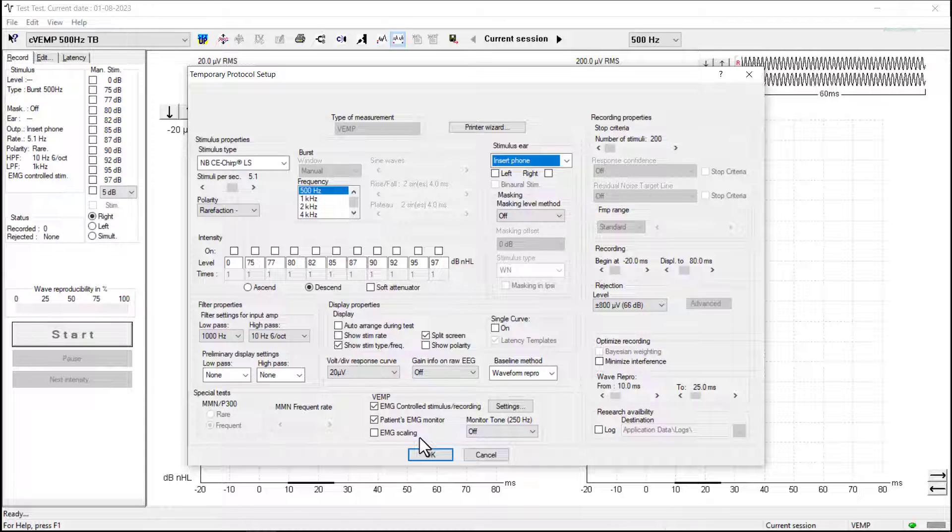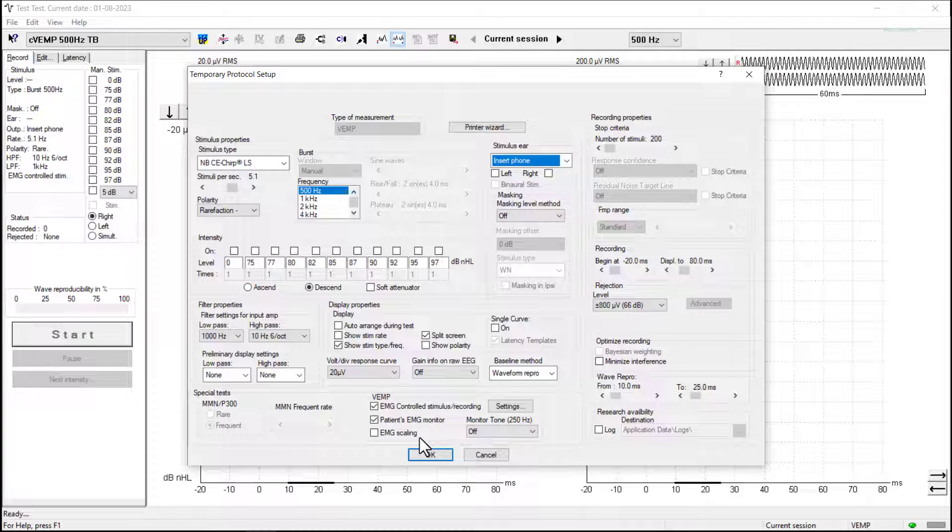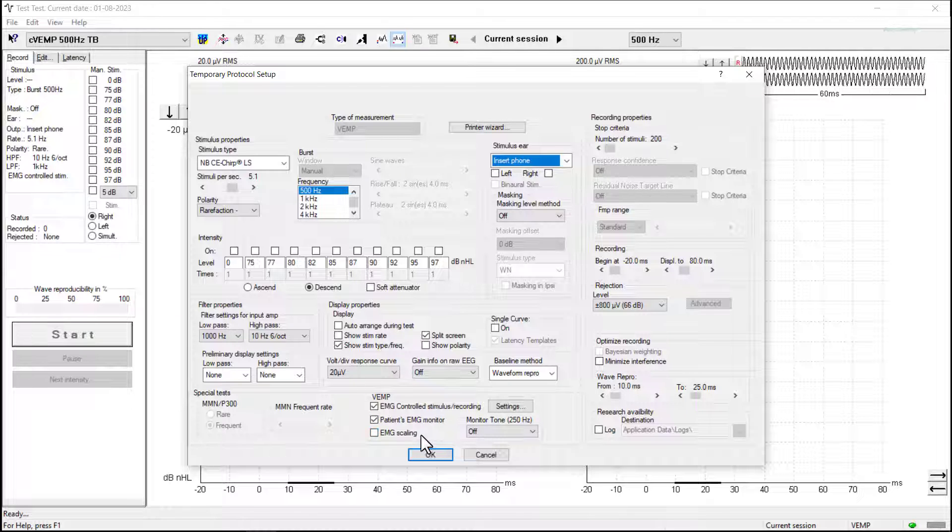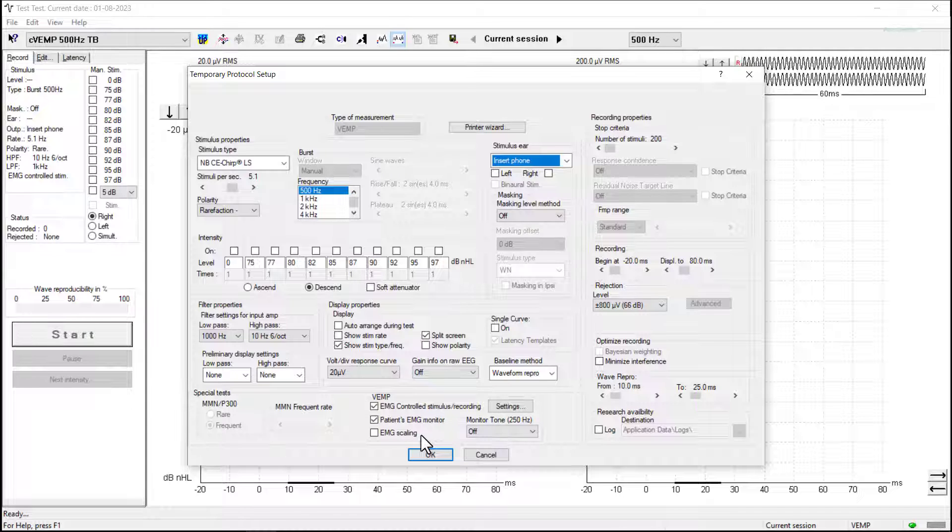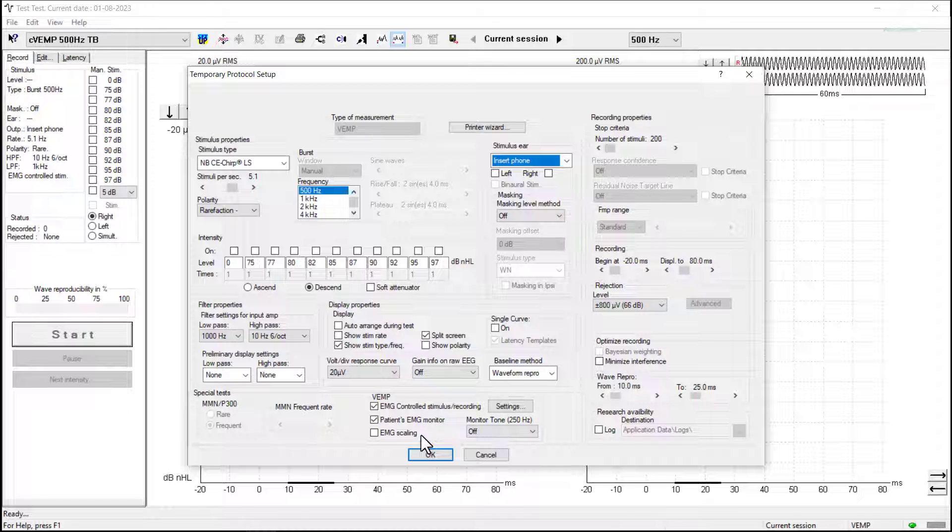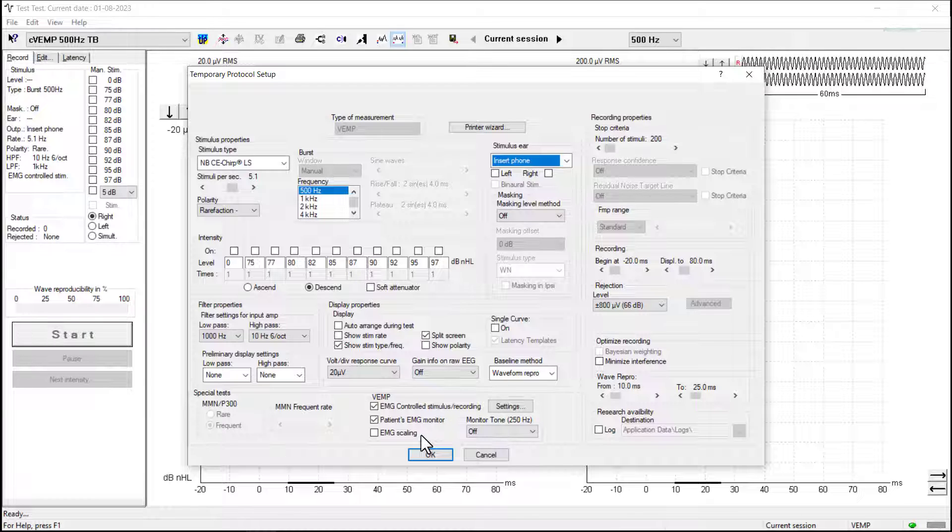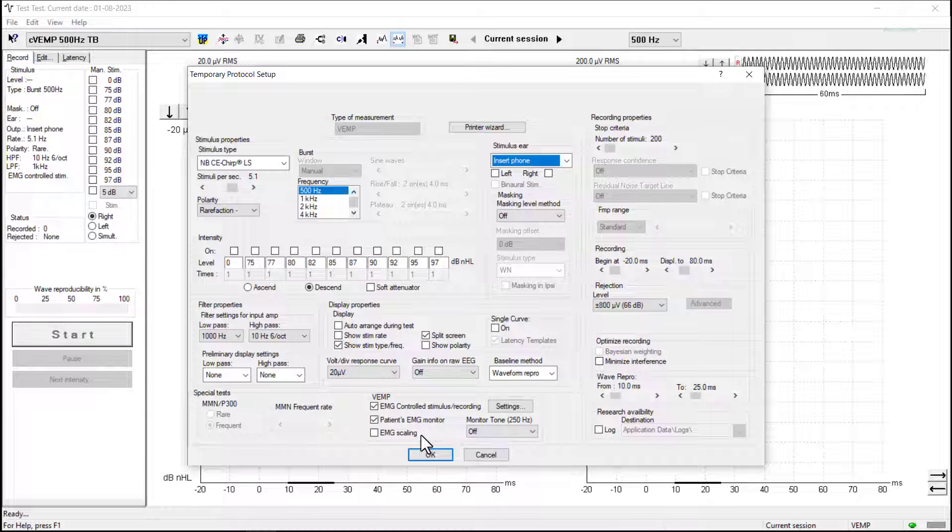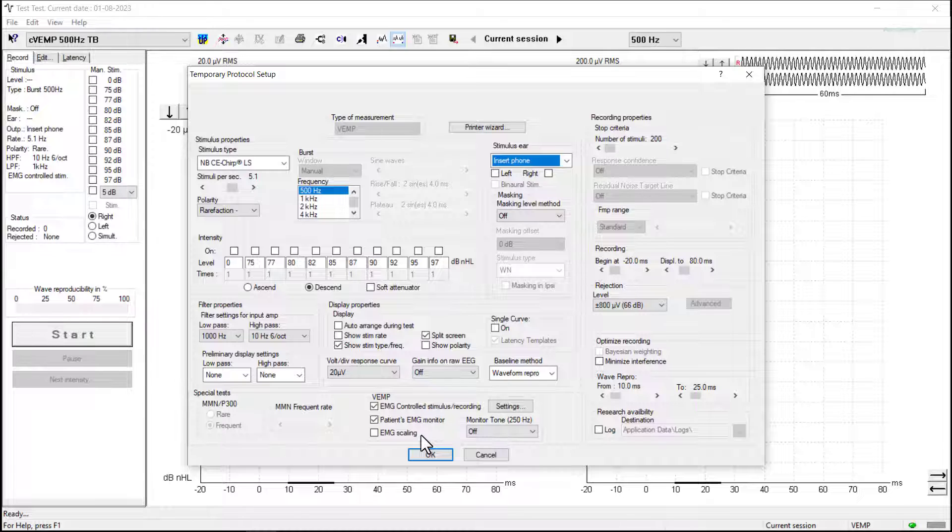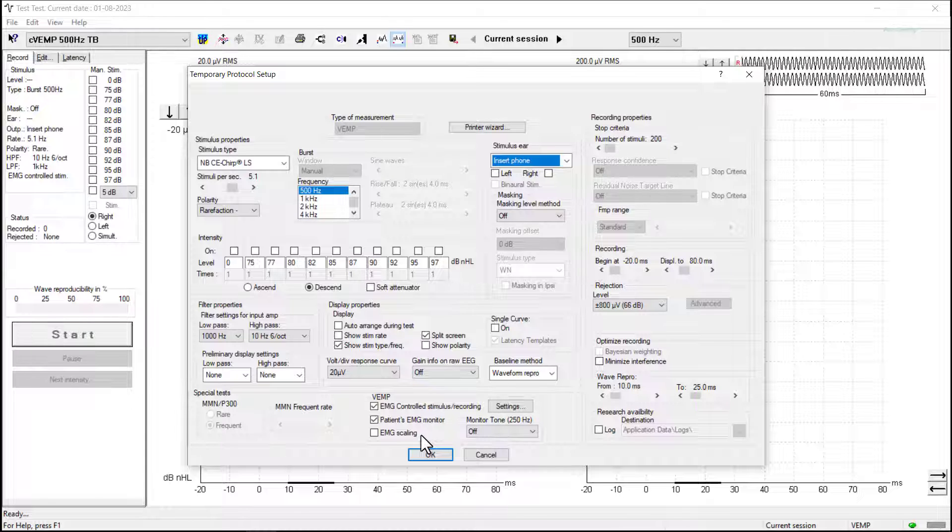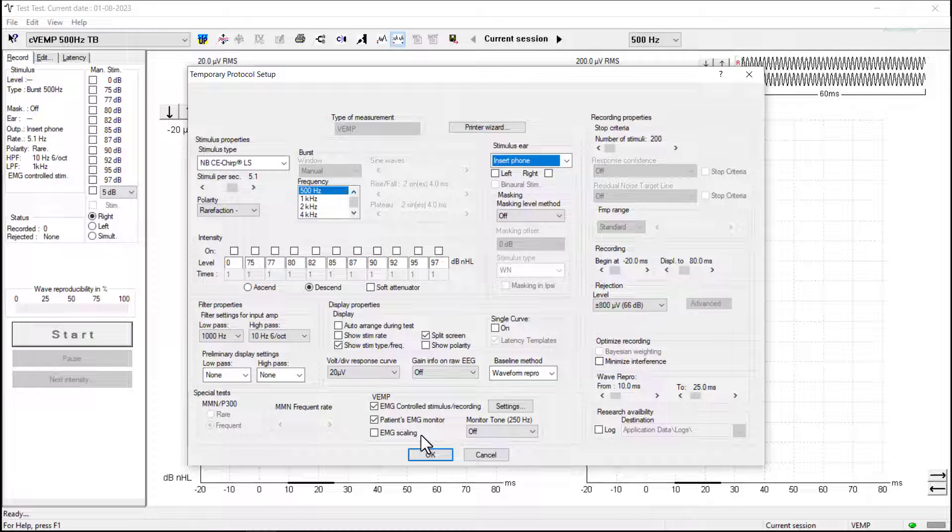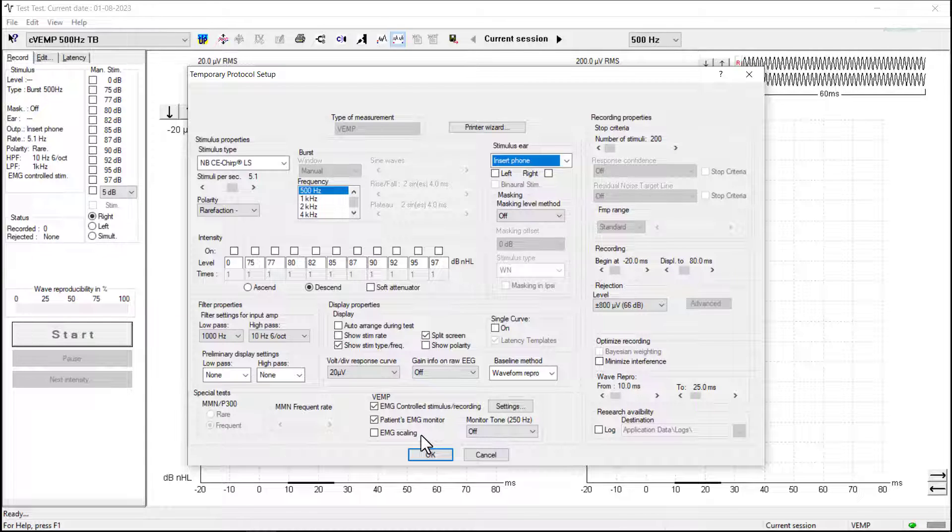EMG scaling is a further option at the bottom of the screen here. I am going to leave this off because I prefer to record my waveforms not scaled and then apply scaling afterwards. You can have this on for the recording. I find it easier to visualize the raw recordings first and then apply scaling afterwards and I'll demonstrate how we can do this later.